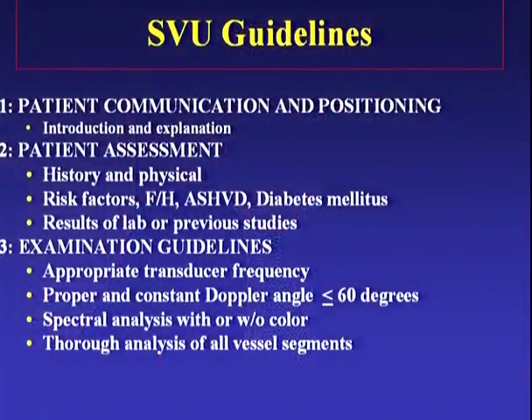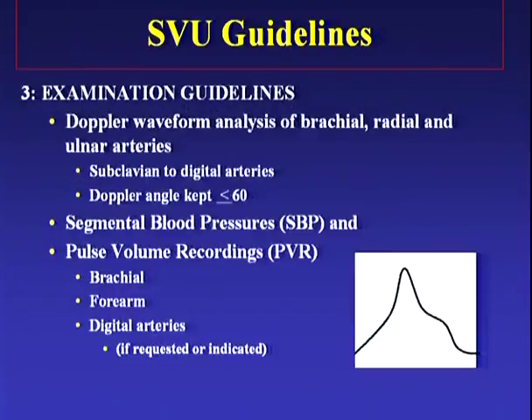Proper constant Doppler angle is very important. You want to maintain a 60-degree angle whenever possible. Never go above that 60-degree angle, always stay below it, and if you do go above it, please take care to note that in your report. Look at spectral analysis and thorough analysis of all vessel segments.